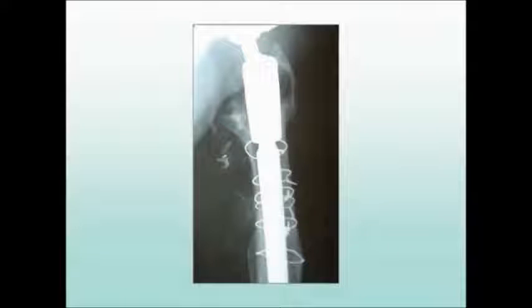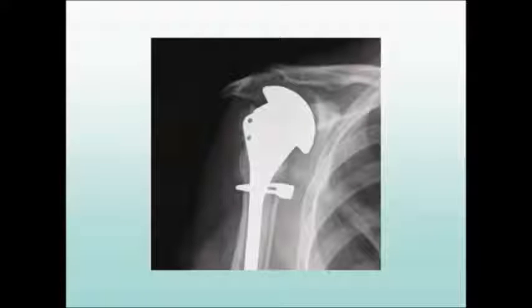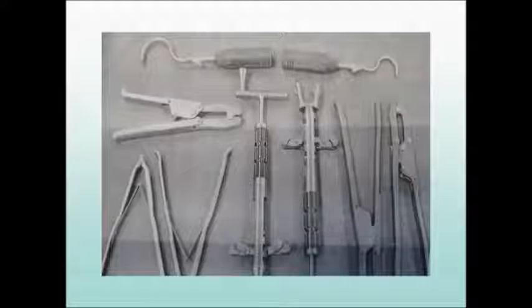First-generation cerclage consisted of monofilament wire. Wire, however, has limited strength and is prone to breakage due to fatigue. Later generation braided metal cable offers greater initial strength and is available with specialized instrumentation that allows for controlled tensioning and locking of the cable around the construct, but still suffers from longer-term fatigue failure that can result in significant clinical complications.